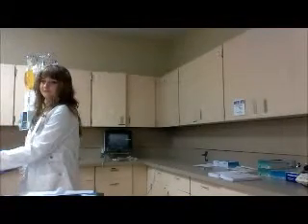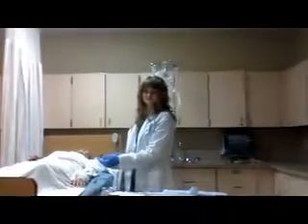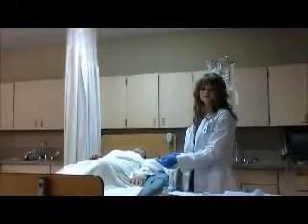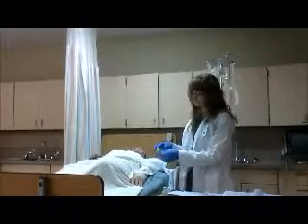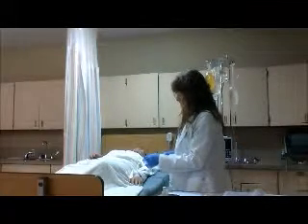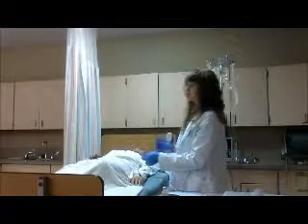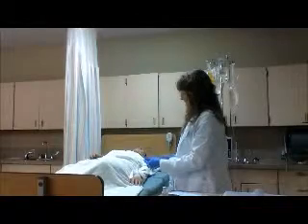I'm going to swab off my port with alcohol, and I'm going to administer the first 1,000 units over 1 minute, so I'm looking at the clock, the rest of it over another minute.